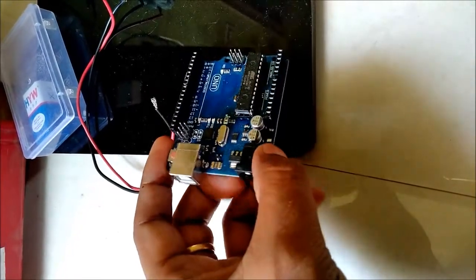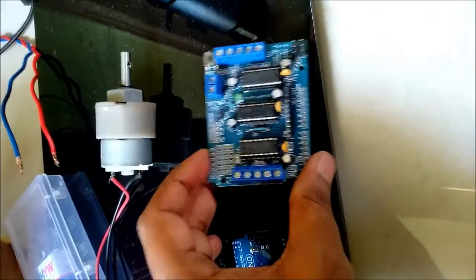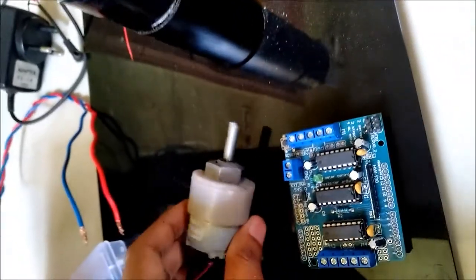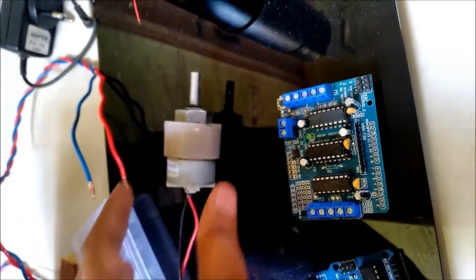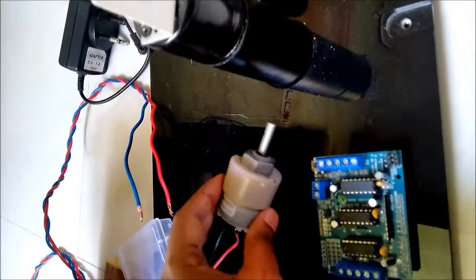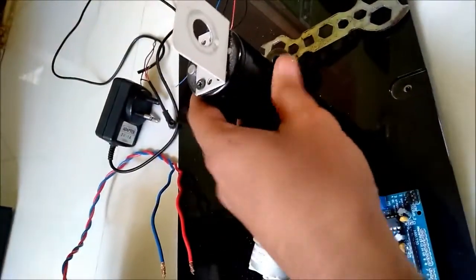Arduino Uno, microcontroller, motor shield, DC motor, 12 volts battery, and attachments to connect to the motor shaft. This is the frame setup, the bracket mounted on it.